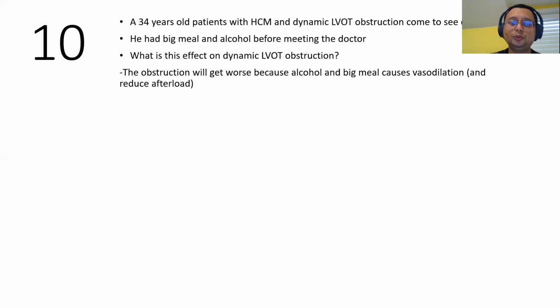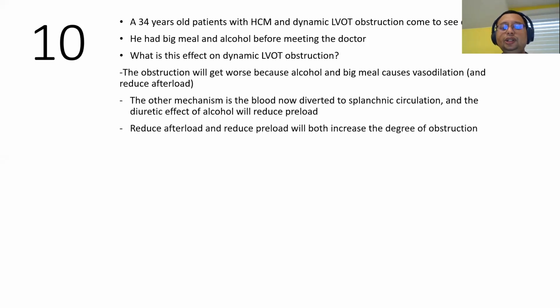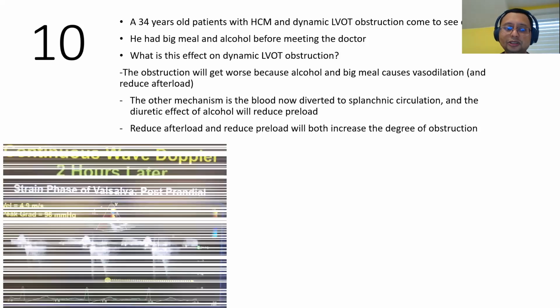Again, the tips for you. Obstruction will get worse with reduction in afterload and reduction in preload. It will get better with increase in preload and increase in afterload. So reducing afterload and reducing preload will both increase the degree of obstruction.